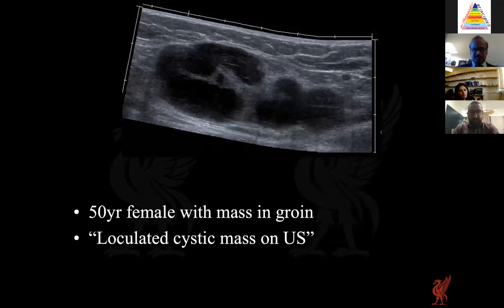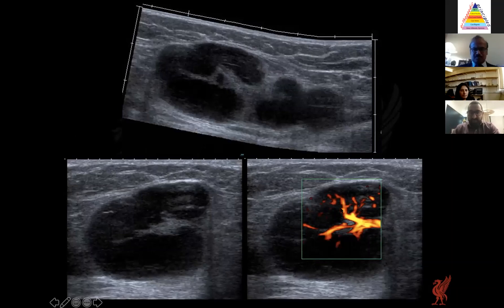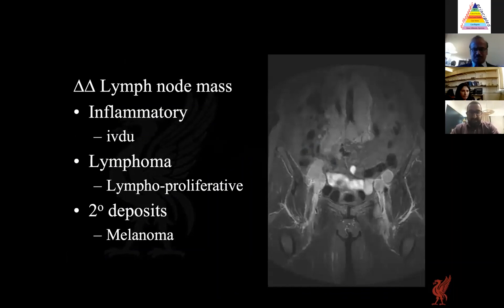Another example of a groin mass was referred as a loculated cystic lesion. On closer imaging review, an echogenic hilum with vascularity was identified and, given its location in the groin, it was likely lymph node in origin. It was diagnosed as lymphadenopathy, which has its own differential including inflammatory, lymphoproliferative, or metastatic causes.